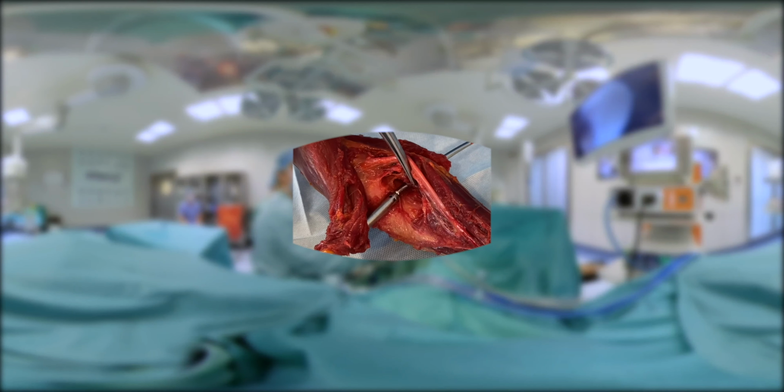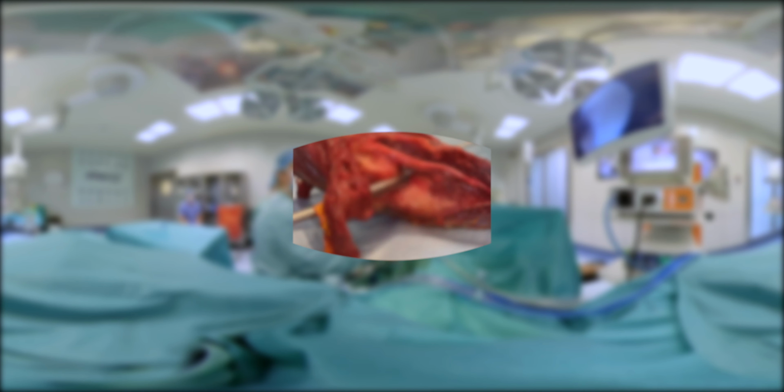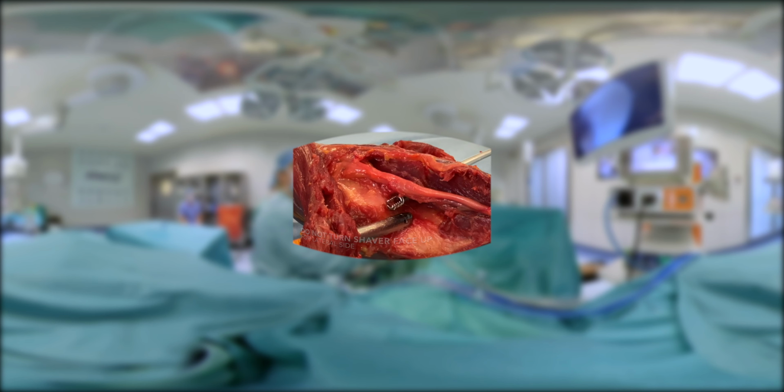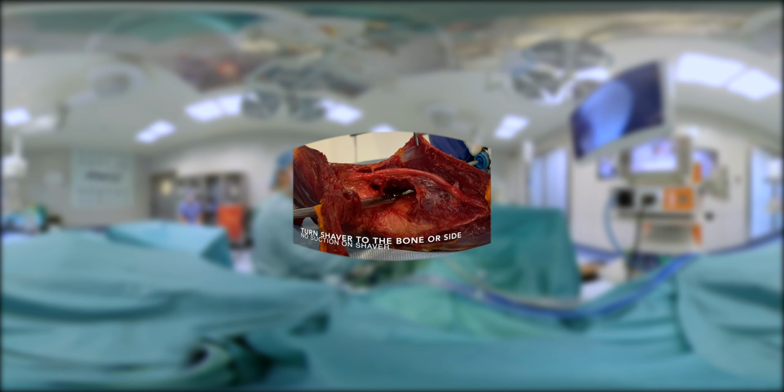While anterior capsule is released or debrided, care has to be taken not to face the shaver up towards the capsule to avoid damaging the radial nerve. Keep the shaver towards the bone or side without the suction attached.